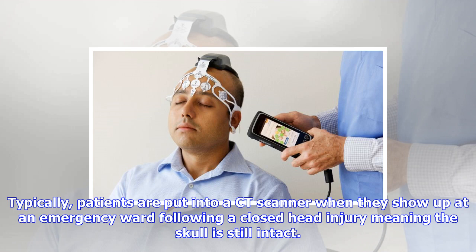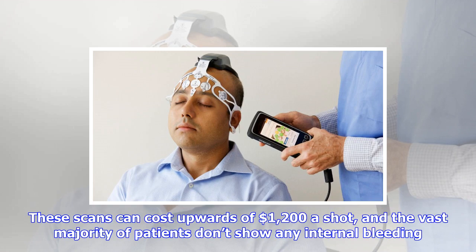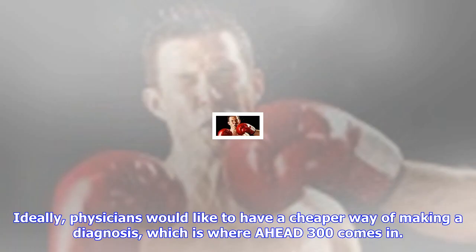During an assessment, the system compares a person's brain activity to the patterns found in normal healthy individuals. For example, it looks at how slowly or quickly information is transmitted from one side of the brain to the other, or whether electrical activity in both hemispheres is coordinated, or if one side is lagging. Importantly, other data can be entered into the system during a diagnosis, including a person's age, whether they lost consciousness as a result of the injury, and their current level of conscious awareness.